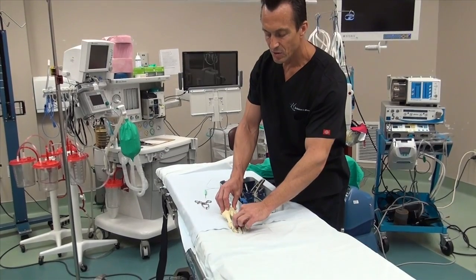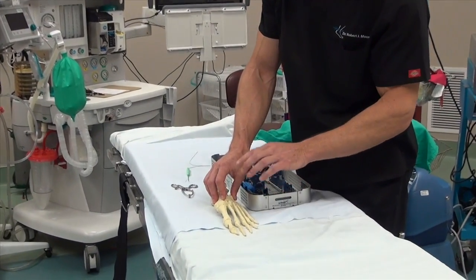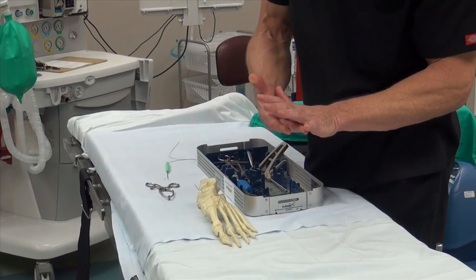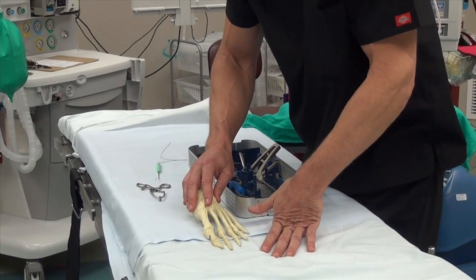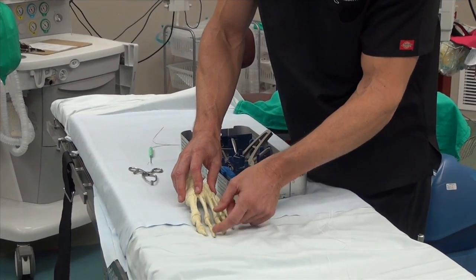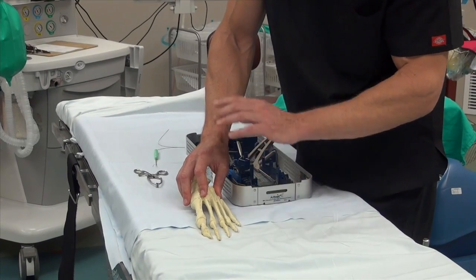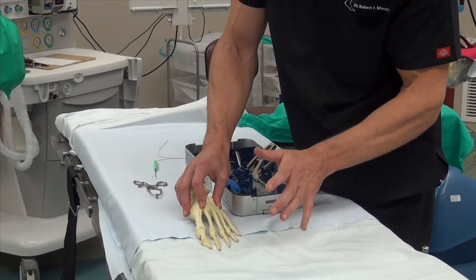This system fixes the plantar plate rupture which causes the second toe to be dislocated upward. Some patients with forefoot pain that come into the office will push the foot this way, rupturing the plantar plate at the bottom and pulling the toe upwards into a partial dislocation. They're absolutely miserable.